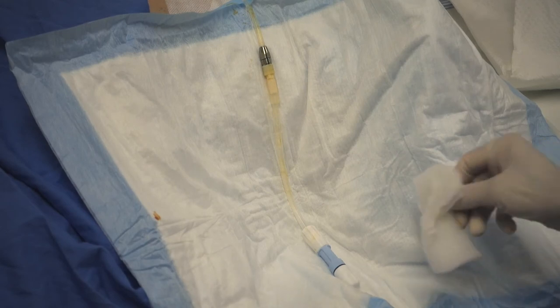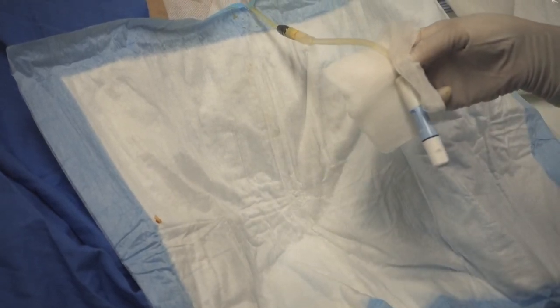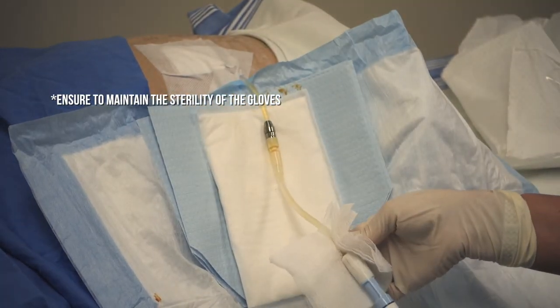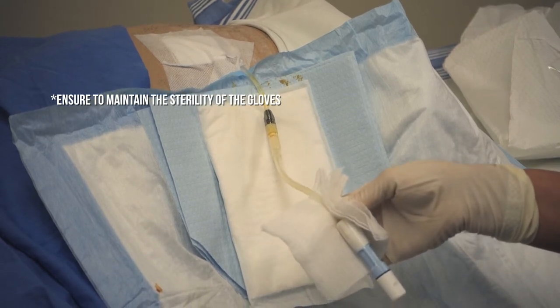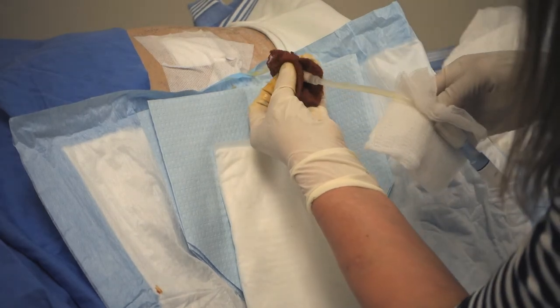You will pick up the catheter with a sterile gauze and place the sterile drape underneath the connection. You will want to maintain the sterility of your gloves. Then you will take a gauze moistened in povidone iodine and you will scrub the connection for 30 seconds.